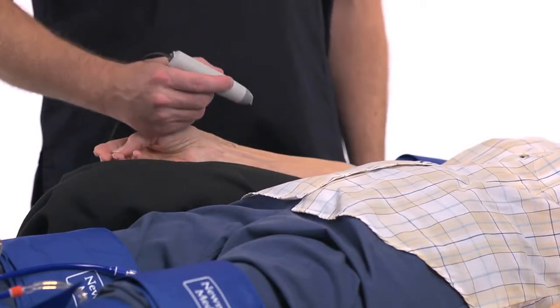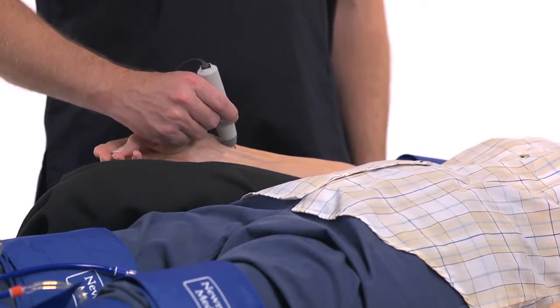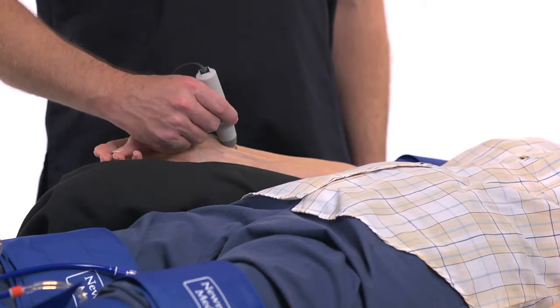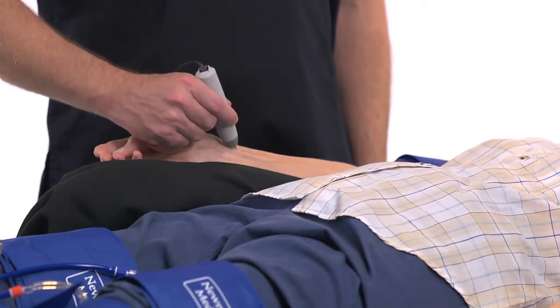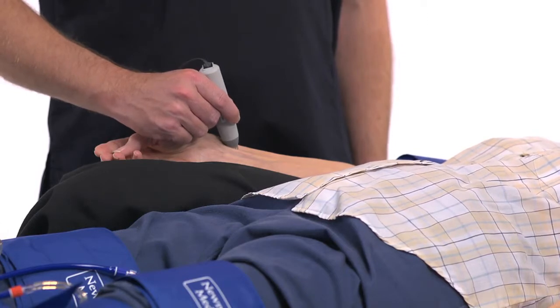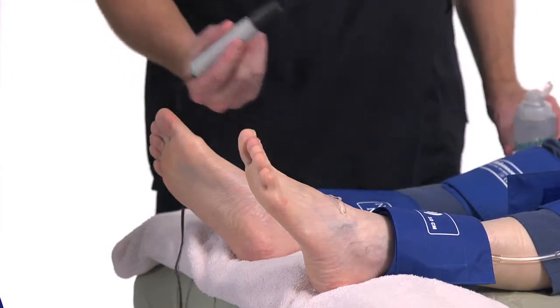Correct use of the Doppler is critical to accurate results for ABI and segmental tests. It may take practice to become comfortable using the Doppler, but you will soon gain confidence. Start by holding the probe like a writing pen; it helps to rest your hand on the patient's limb to steady the probe. With any Doppler probe, use plenty of gel. Hold the probe at a 45-degree angle to the skin for the best sound. Point the probe proximally along the length of the artery. Press lightly so that you don't occlude the flow with the probe tip. Slowly move the probe across the artery until you hear the loudest sounds. A key when taking pressures is to keep the probe in place as the cuff is inflated and deflated, even when the sound disappears when the artery is occluded by the cuff. The Newman Medical Angled Standoff or Cheater can help with holding the probe at the correct angle and keeping it in place, and also helps to keep from pressing so hard that the artery is occluded.